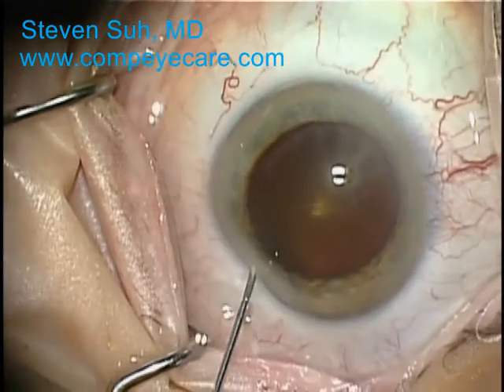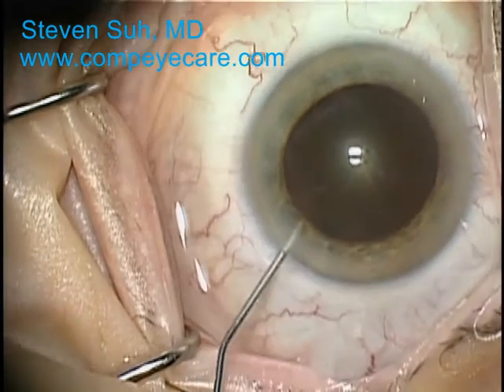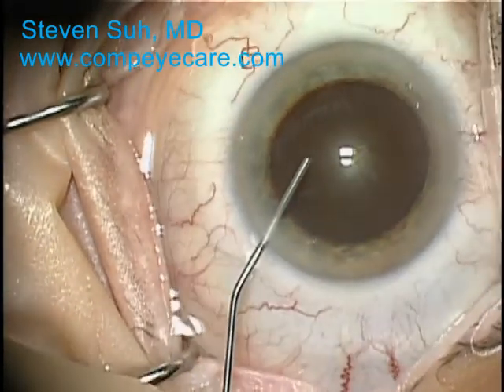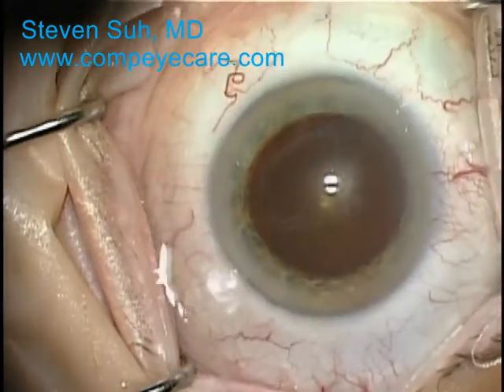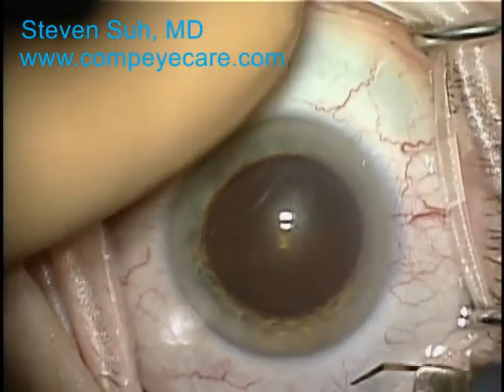Here I am injecting viscoelastic material, which is a clear and colorless viscous substance that helps to keep the eye inflated during the procedure, and it helps to protect the delicate inner layer of the cornea, called the endothelium.